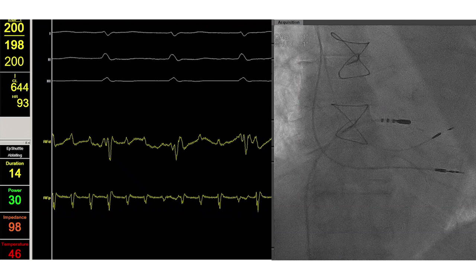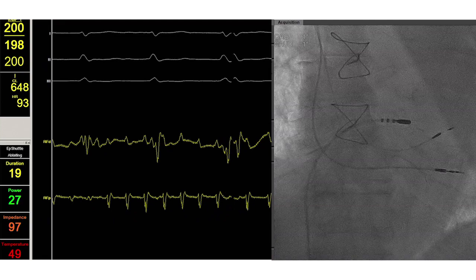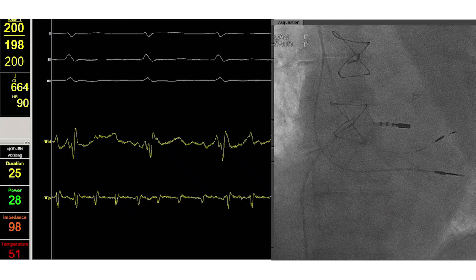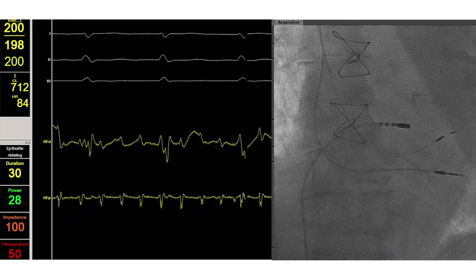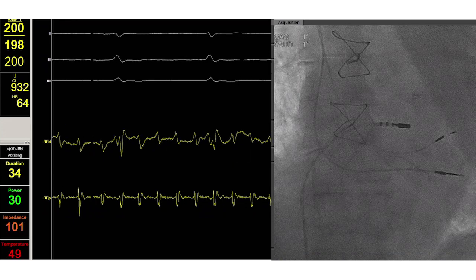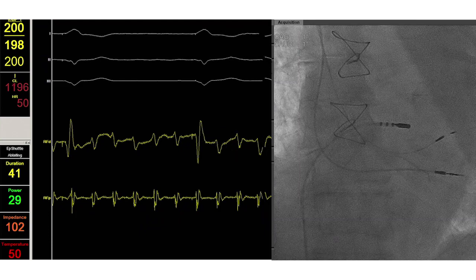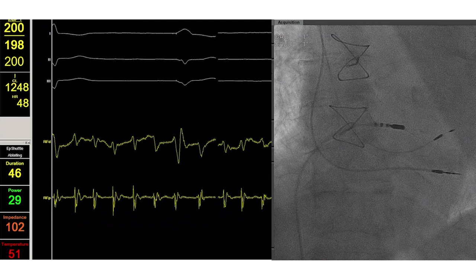We are now starting to apply radio frequency energy on this area. It is important to observe changes in power, temperature, and impedance. Watch closely the ECG — we will see that the initial acceleration will change into a slowing of the AV nodal conduction. And now AV block with pacing at a lower rate, 50 beats per minute.